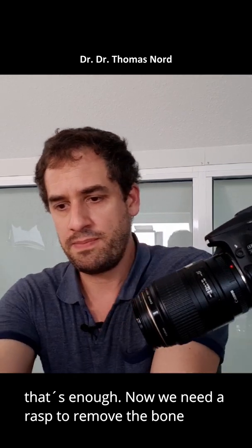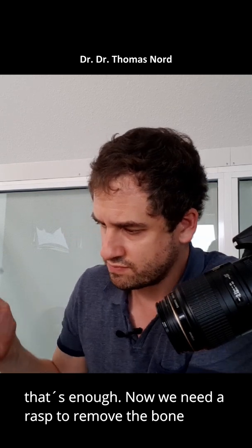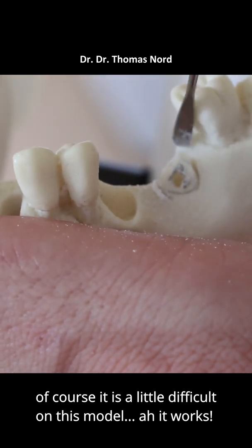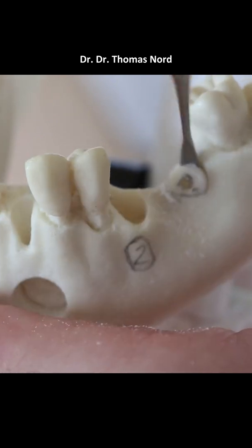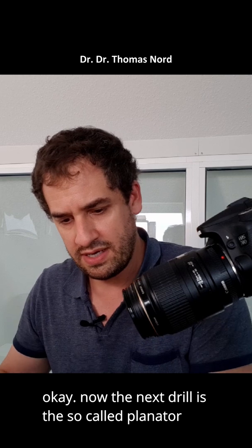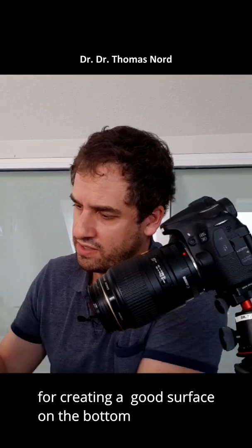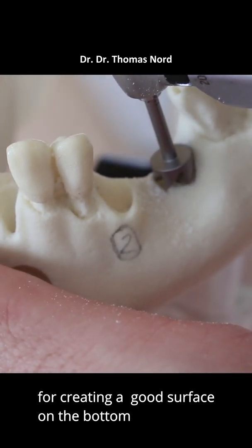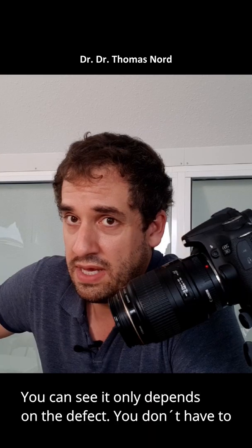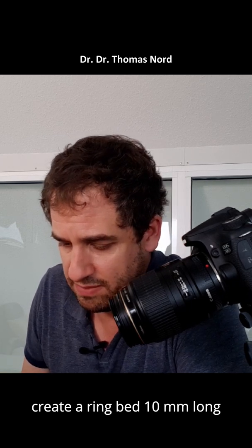Now we need a rasp to remove the bone. Of course it's a little bit difficult with this model. Now the second drill is the so-called planator for creating a good surface on the bottom. You can see it only depends on the defect — you don't have to create a ring bed 10mm long.